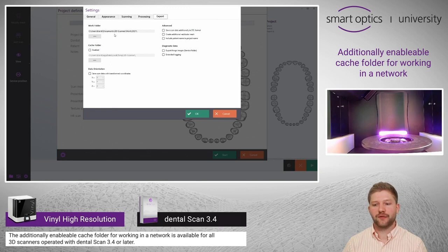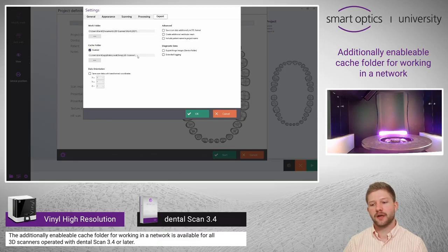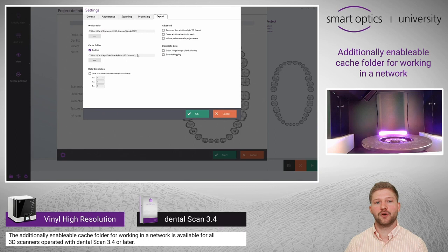If your work folder is within the network, the calculation of your scanning files may take some time. Therefore you can choose the cache folder, enable it and choose for example a local SSD card.